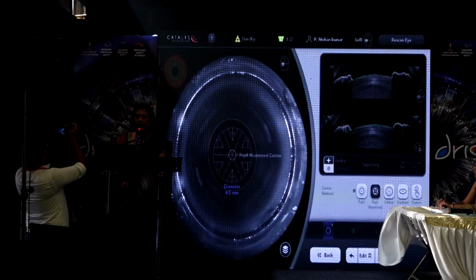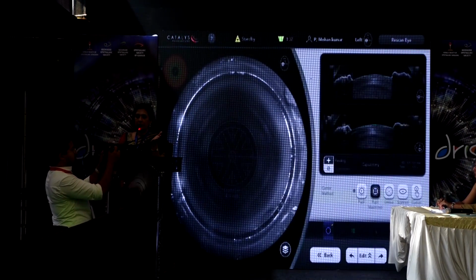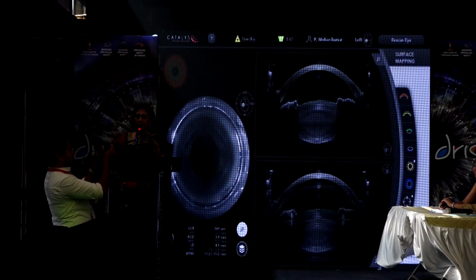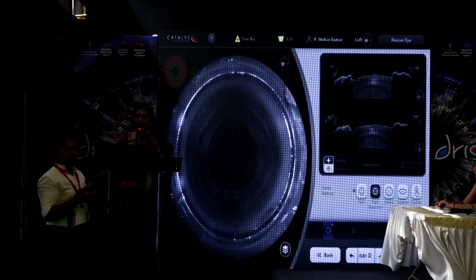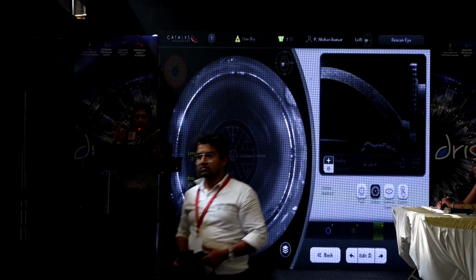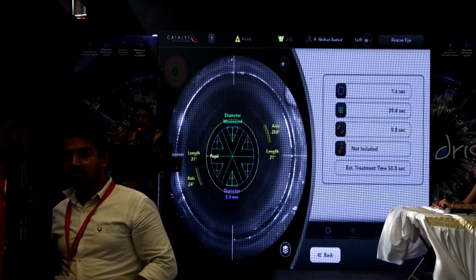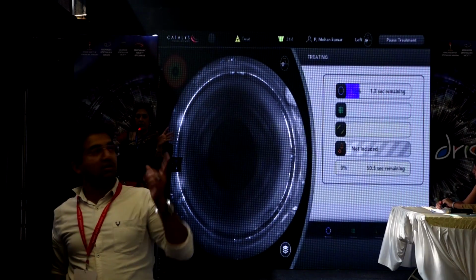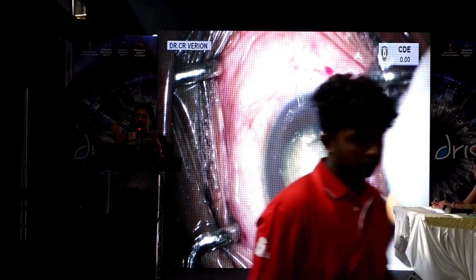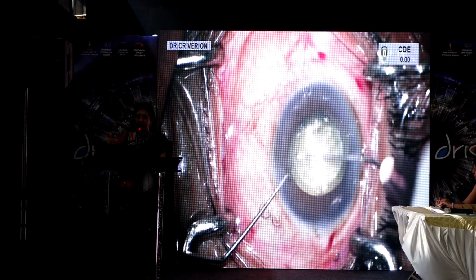When the pupil does not accept it, you have the ability to go to the pupil maximized button. You can press that, which will give you the maximal pupil size, but you can cheat the machine and use your cursors to enlarge the rhexis so that it comes within 100 micron of the iris margin, because it will not impact the iris or cause miosis because of the prostaglandin release if that 100 micron space is there. And then with that, a decent 5mm rhexis could be worked out.